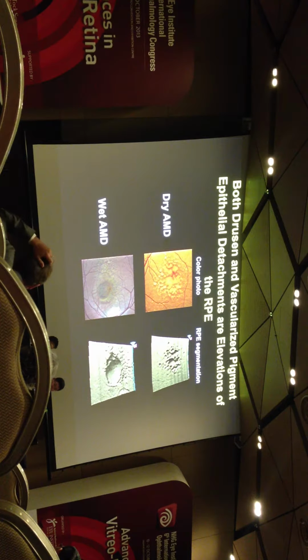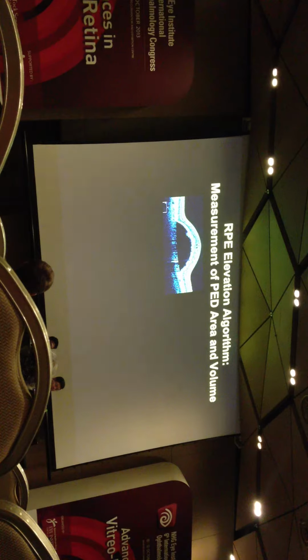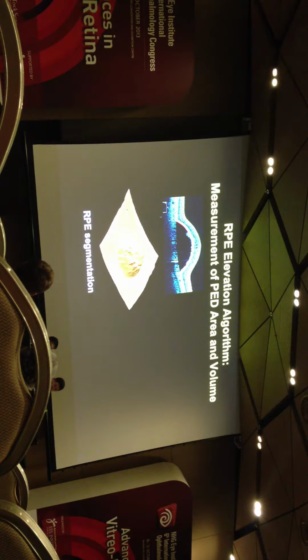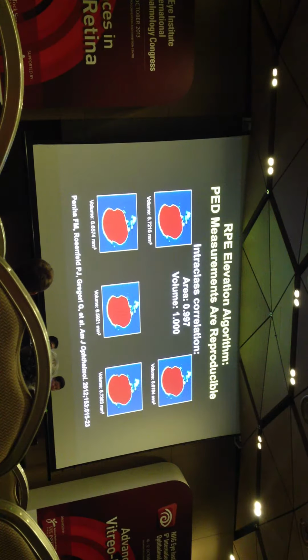So, what's the difference between typical soft drusen and vascularized or non-vascularized pigment epithelial detachments? And the answer is not much, because you can use the same strategy to visualize and quantify PEDs. So we did the exact same thing. We looked at the PEDs, the RPE segmentation, the virtual floor, we subtracted the two, and now we have an area and volume measurement of PEDs, which is particularly useful for polypoidal lesions. And it's highly reproducible and reliable.